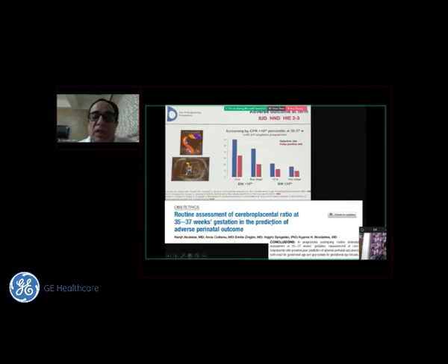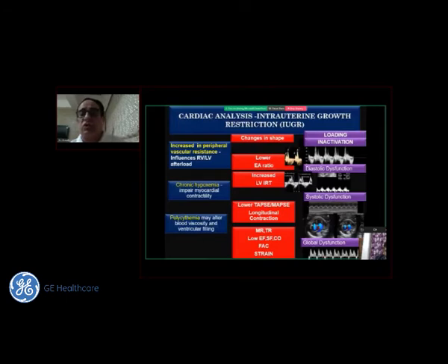And then, of course, we have a lot of pros and cons, and now CPR has published one more paper, and there are other papers which tell us that the CP ratio may not be as beneficial as we thought it to be. Of course, the final word is not out, but it goes to show that we need to continuously evaluate these fetuses and do research.